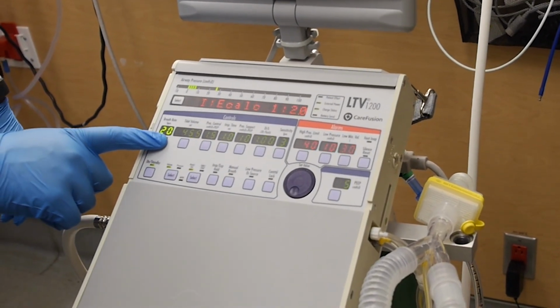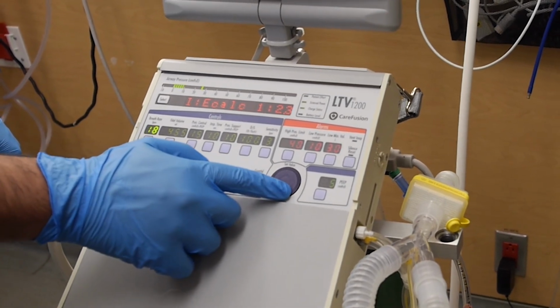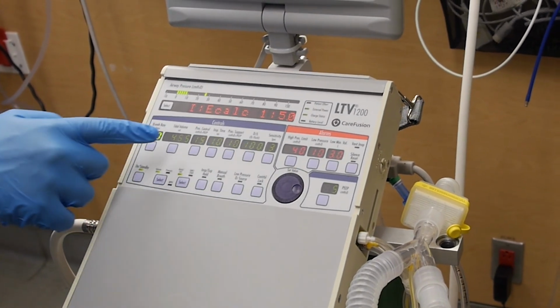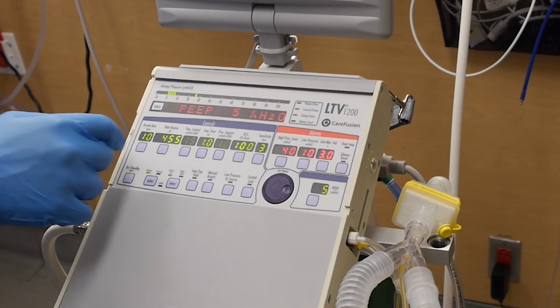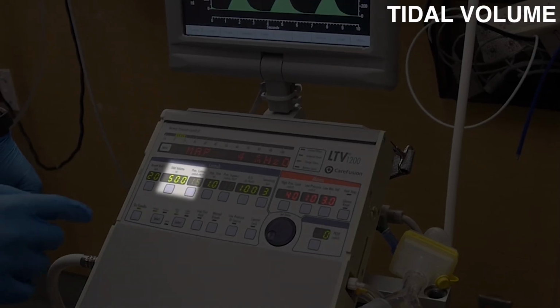We have chosen a breath rate of 20 breaths per minute for COVID-positive patients with previously normal lungs. Patients with a history of obstructive lung disease should start with a rate of 10 breaths per minute to allow them greater time to expire. These patients do very poorly on a ventilator, and you should call for help immediately after intubation, emphasizing their underlying lung disease. Tidal volume is the second setting.